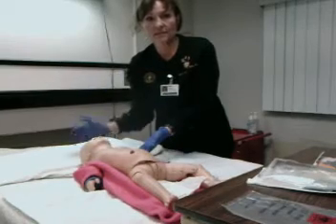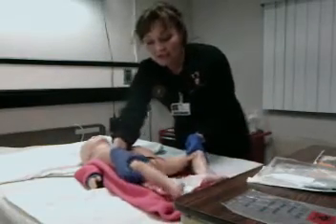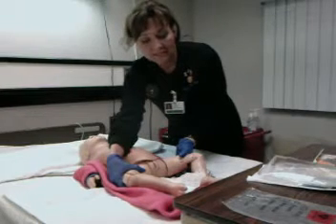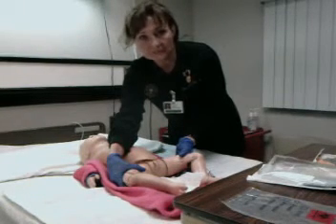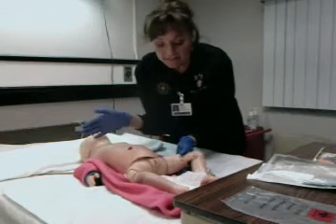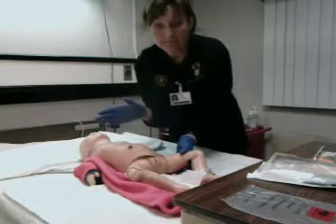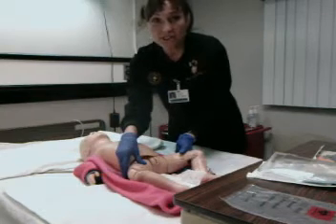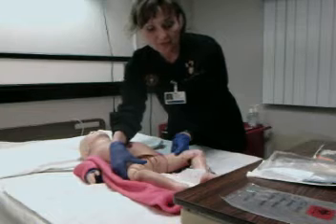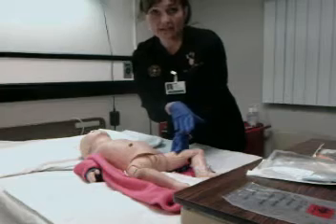Your directions will say when you read the procedure that you abduct the hips. Think about how this baby is positioned — if I try to lean across, what happens to the airway for this baby? And this baby is probably going to be screaming and crying. You'll have to work through the crying. Have somebody up at the head to hold the shoulders, and then somebody across the lower half to abduct the hips and open things up. Those individuals, especially the one at the legs and hips, should have gloves on.